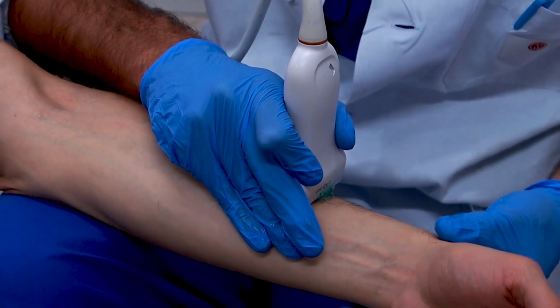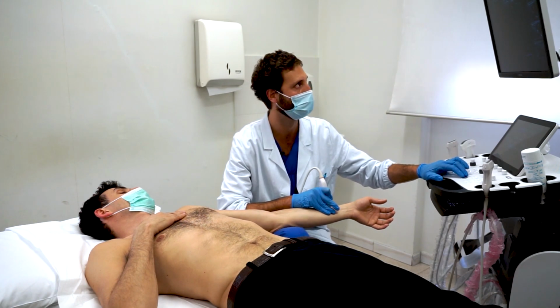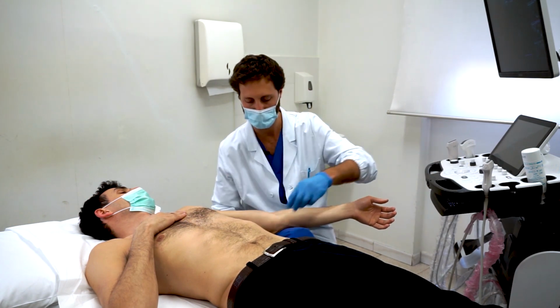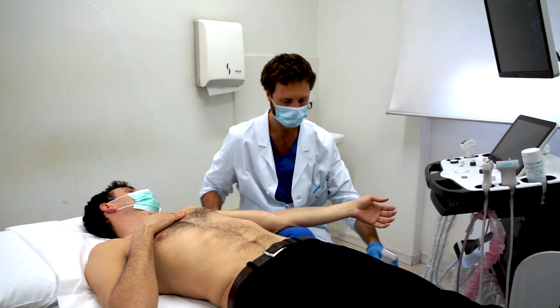At this point, it could be useful to change your probe and to evaluate the nerve with a higher frequency probe. In this case, we can use an 18 megahertz linear probe.